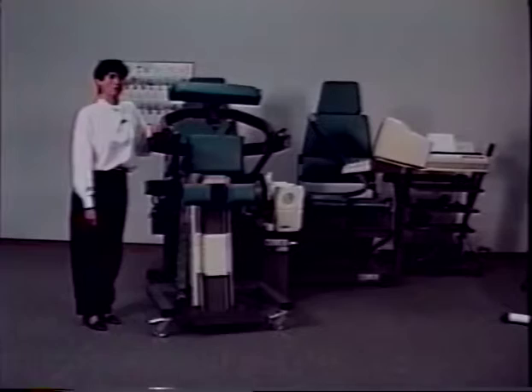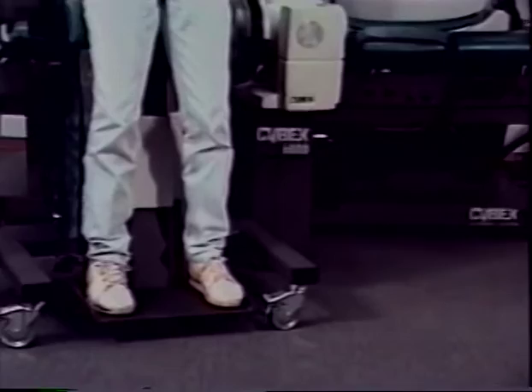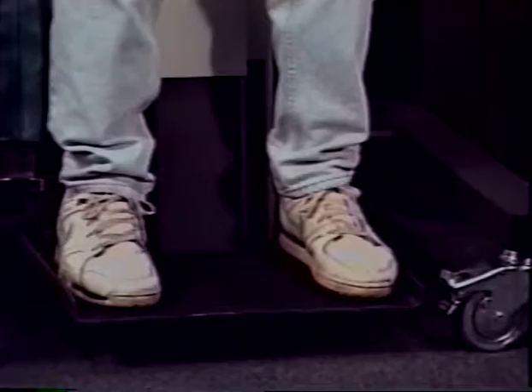I'd like to demonstrate a proper patient setup. First, have the patient step onto the foot plate. Place both heels firmly in the heel cups. You can raise or lower the foot plate as needed to align the axis of rotation of the patient with the mechanical axis of rotation of the TEF modular component.